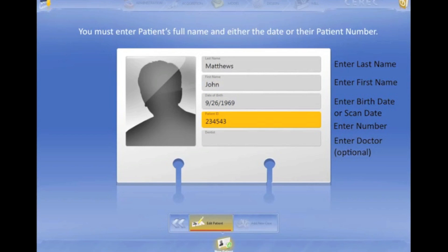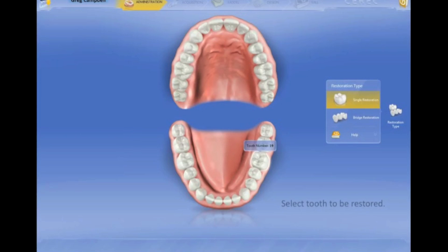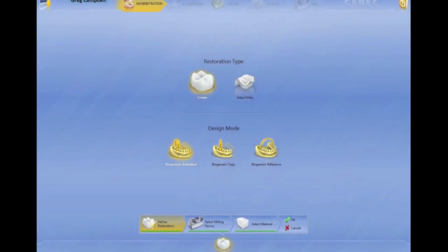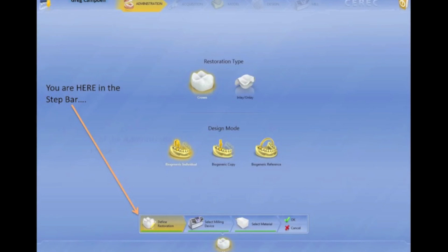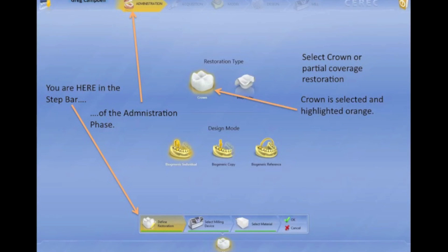Once you're done here, go ahead and hit Add a New Case. When you click on Add a New Case, it's going to take you to what looks like a typodont — I love these photorealistic elements for the new software. You're going to select a bridge or a single unit, select the tooth number, and then it's going to bring you to this screen, which asks you what you're doing. Are you doing a full crown or inlay-onlay? Remember, if you have any part of a cusp remaining, you have to call that an inlay-onlay in our CEREC software.